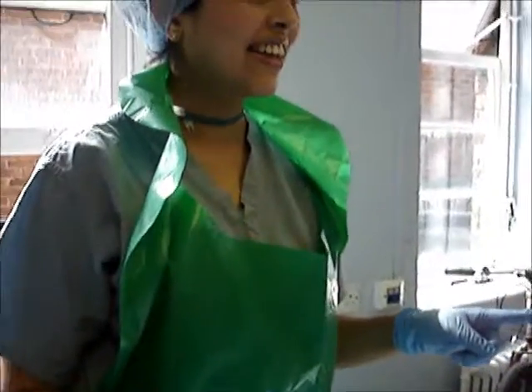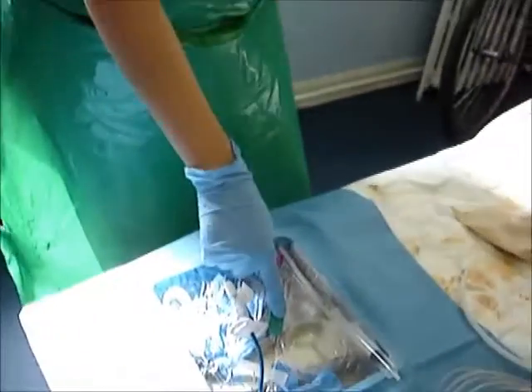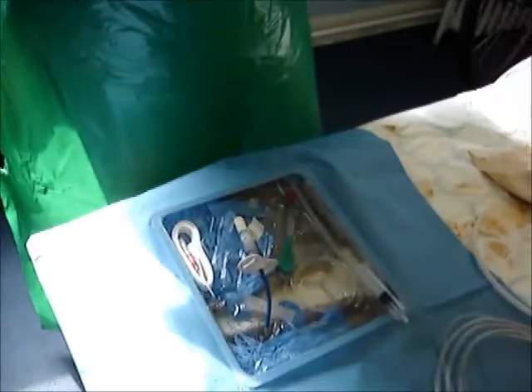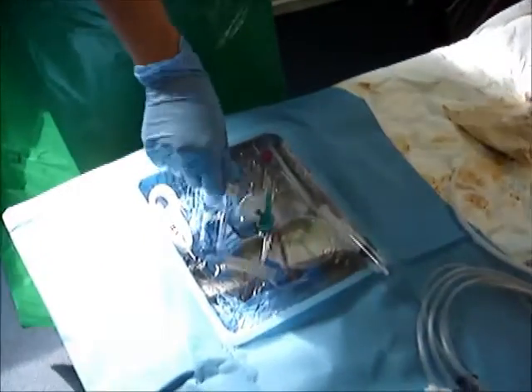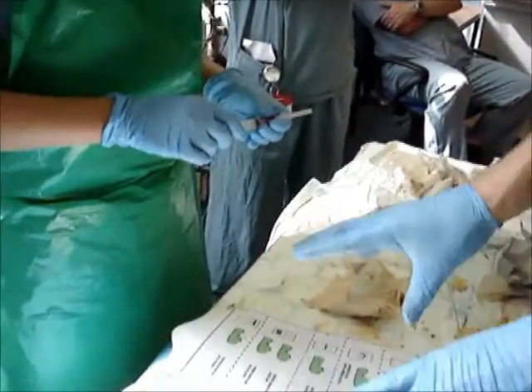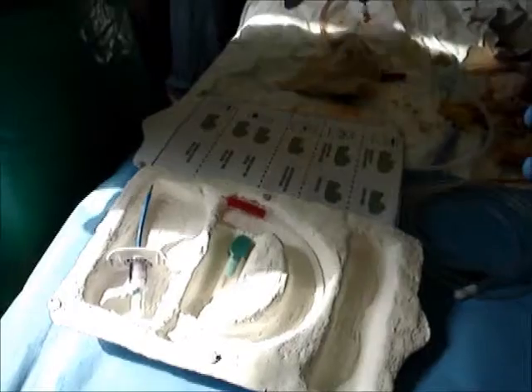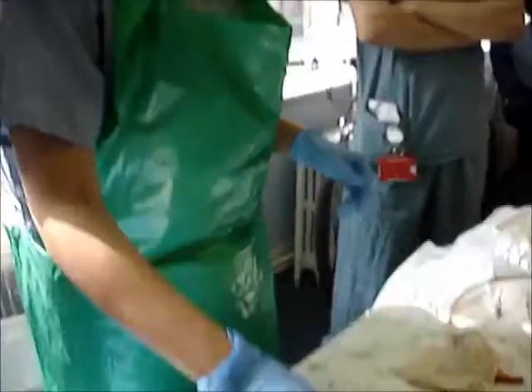In fact, I didn't even figure out where the dilator is until I made a stab, and then I was like, there has to be a dilator. That's there. But then I picked up the dilator. As somebody who's slightly familiar with this type of kit, all they needed to know was, this is a needle, guide wire, slash, dilator thing. Do you know what I mean? That's as much as you need to know. Yeah.